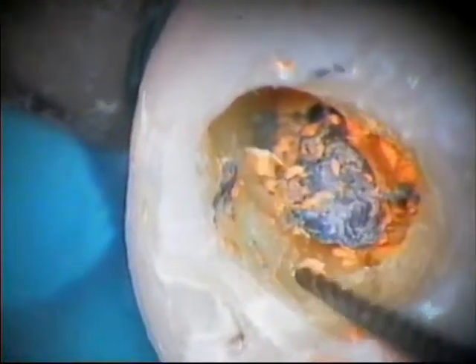The most common and cleanest technique involves drilling down alongside the carrier with an 04 or 06 tapered instrument until it binds in the plastic carrier. This example begins with the use of a Profile 30.04 tapered instrument. Between 1500 and 2500 RPM is appropriate.